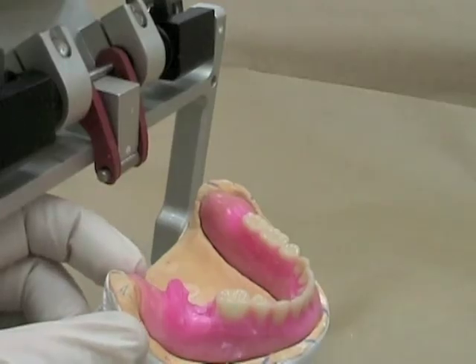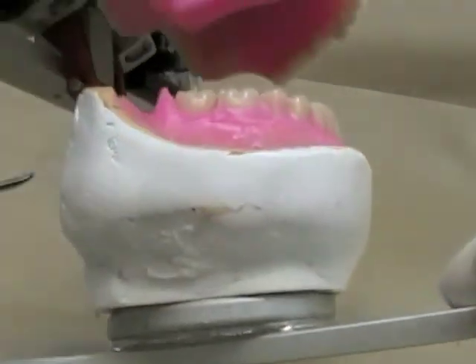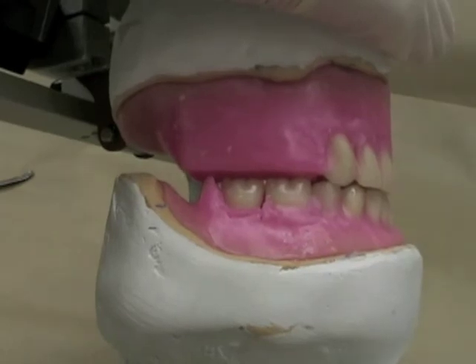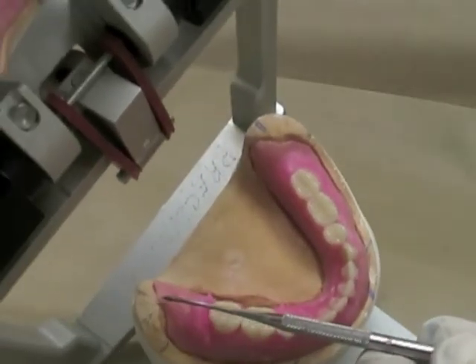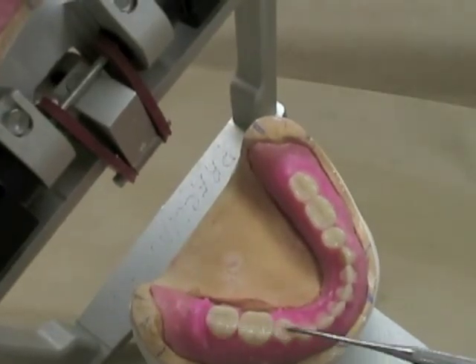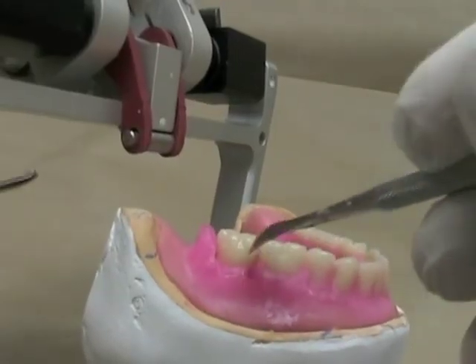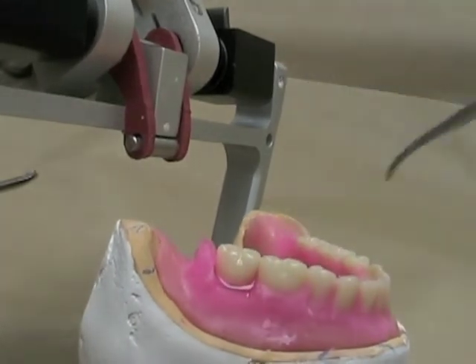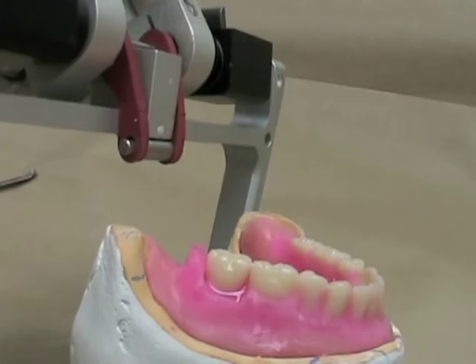We've removed the wax for the second molar and we're going to place the tooth in there. Look from the side to make sure it's coming close to where your occlusal plane is, and from above it should line up with that reference line from the arch down the center of the ridge to the front. Soften the wax a little bit around the tooth, but not all of it — you might still have to make some changes, so don't get too much wax around the teeth at this stage.